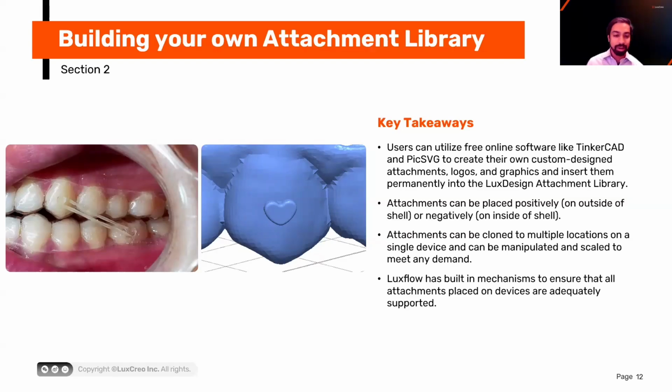Yeah, and I do. And a quick note about putting art on your aligners. A lot of our doctors have found that kids have a hard time being compliant.